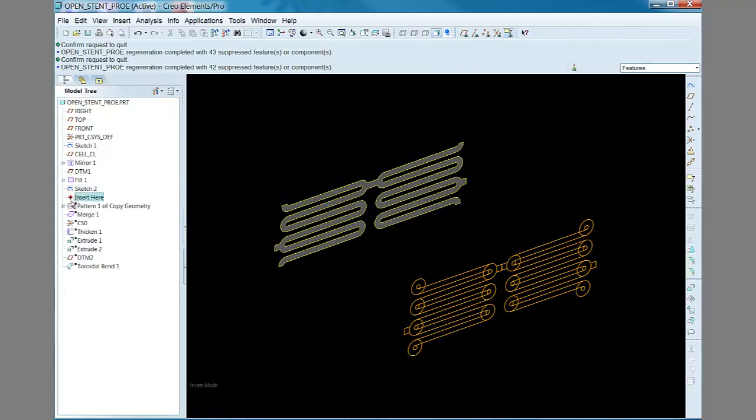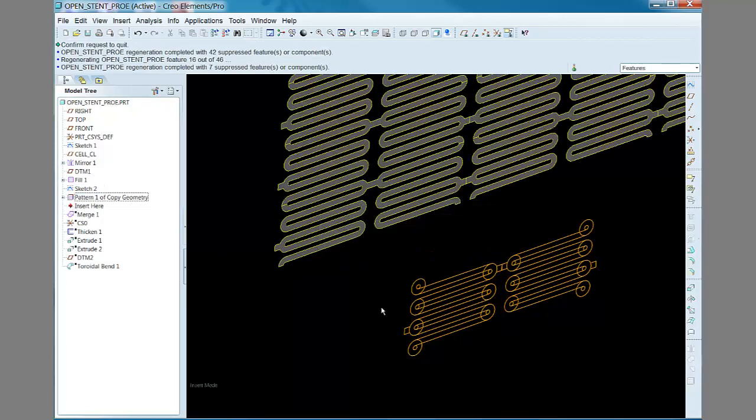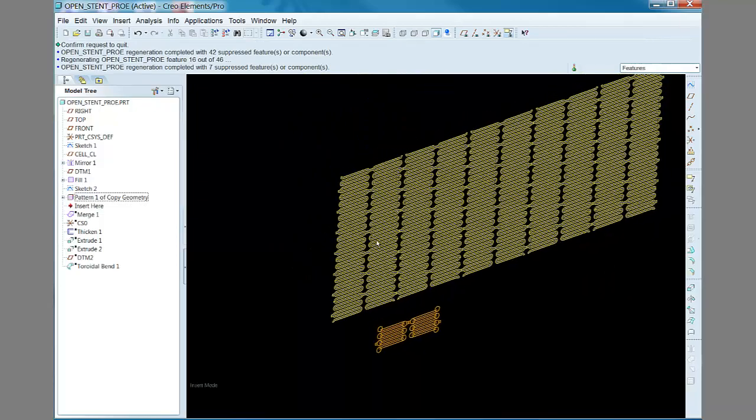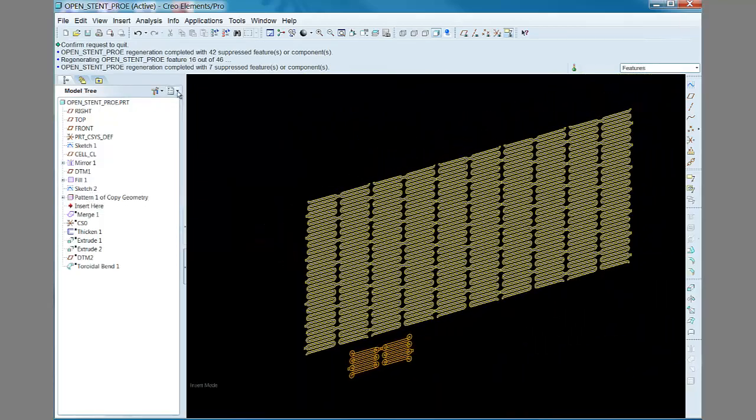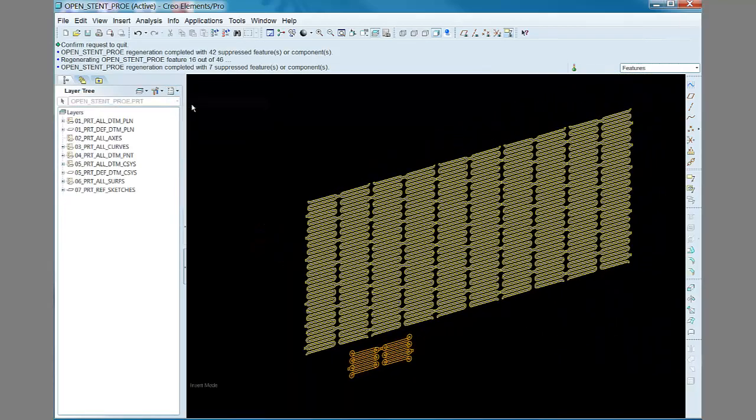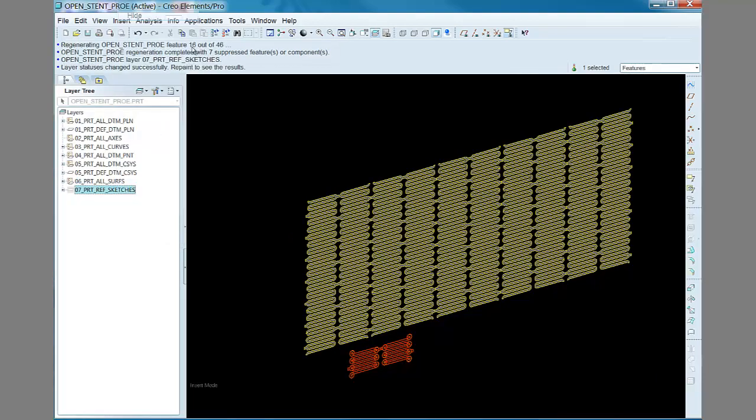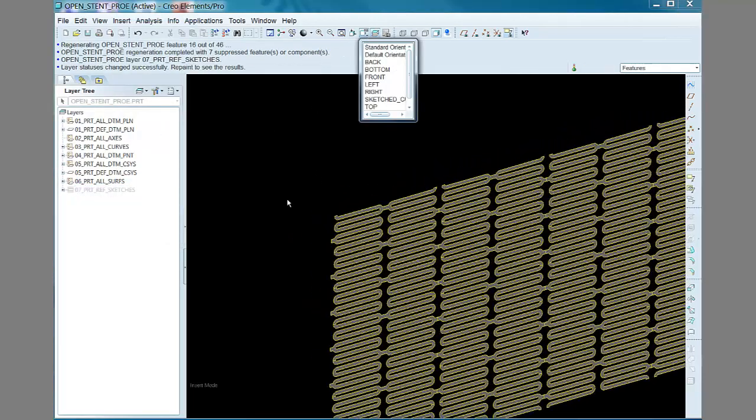So the next step in the method is to pattern the unit cell surface in the x and y directions. With regards to creating patterns, I found that patterning the surface feature, rather than patterning a solid feature, led to much faster regeneration times for the model overall.